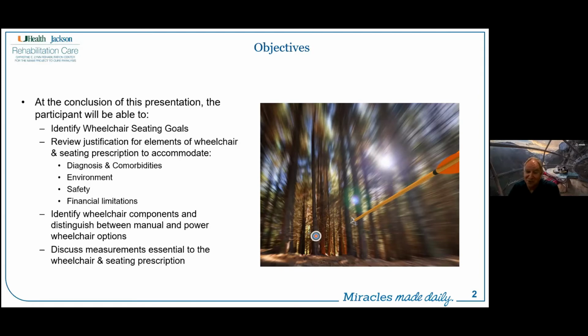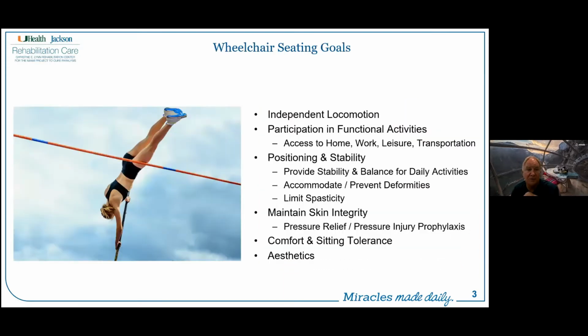And then we're going to spend some time talking through the measurements specific for our PTs and OTs, but the physicians on the group ought to know this as well. Those components that are absolutely essential to wheelchair and seating prescription. And we'll finish off a little bit on the seating dynamics and how to make sure that we meet the seating goals as we go through.